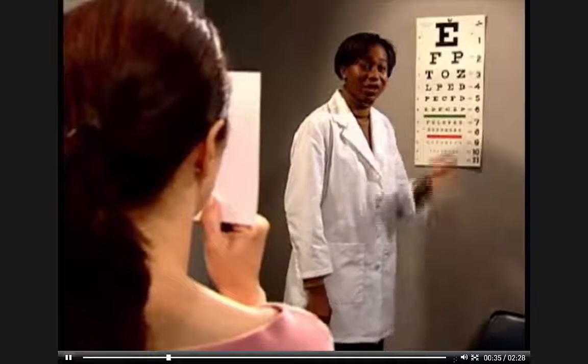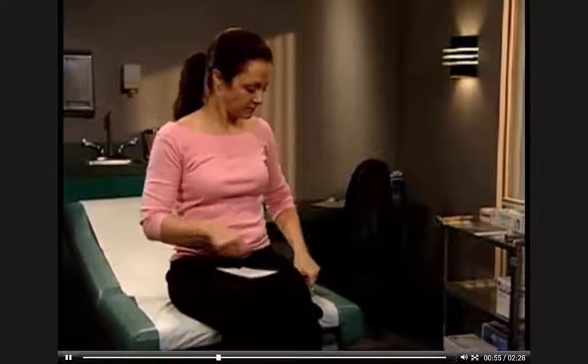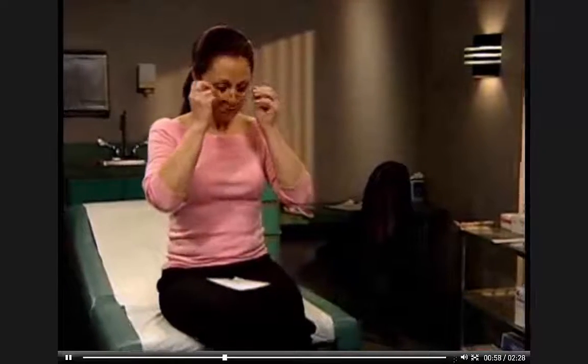P-E-C-F-D. Can you read anything on line 6? Maybe, but the letters aren't clear. Okay. Now cover your left eye with the card and tell me which line you can read clearly. Line 5 again. Can you read that line backwards? D-F-C-E-P. Now we'll do this again. Put your glasses on and cover your right eye with the card. That would be line 8.